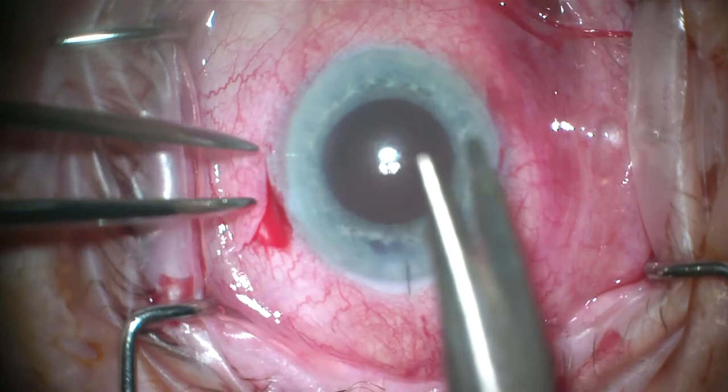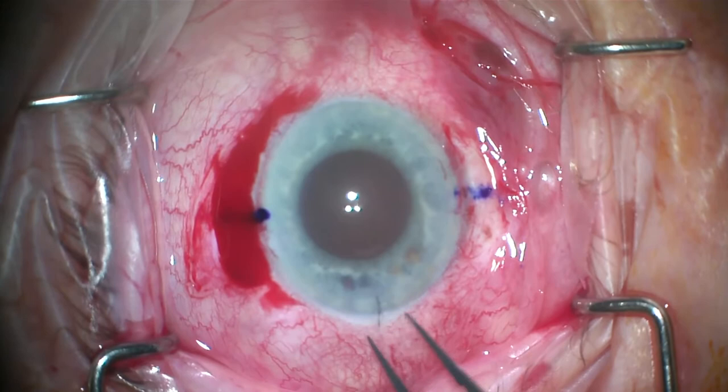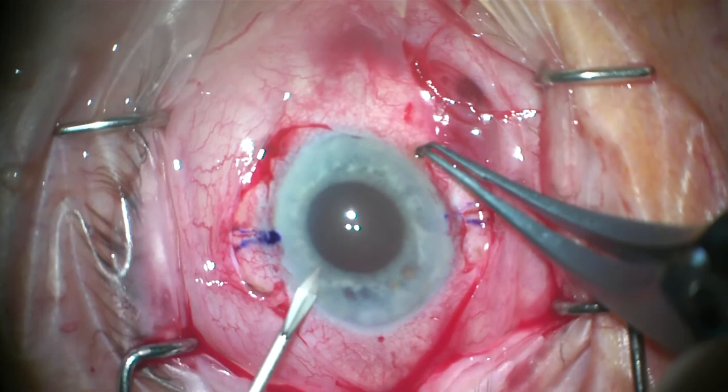First, we create two peritomy wounds 180 degrees apart, bearing 3 mm of bare sclera. A marker is used to mark 0 and 180 degrees. A 3-step corneoscleral wound is created, or you can use a previous cataract surgery wound. A scleral radial cut down of 50% depth is created on both sides, centering at 2 mm from the limbus. Paracentesis is then performed.